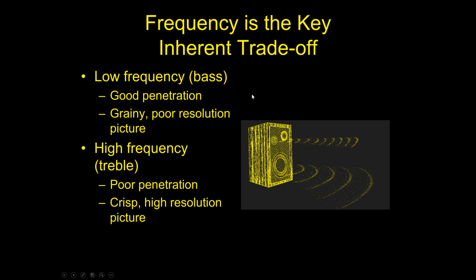Okay. So the thing that you need to remember as far as ultrasound goes is if we're using a low frequency ultrasound probe or a transducer, which we're going to learn more about here in a second, the low frequency probes are going to generate a frequency in the 2 to 5 megahertz range. Okay, a high frequency probe would be one that's going to generate sound waves in the 12 megahertz and above range. Okay, so the low frequency probes that we would use in ultrasound, they have good penetration and poor resolution.